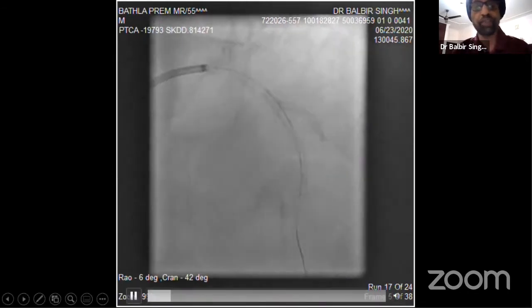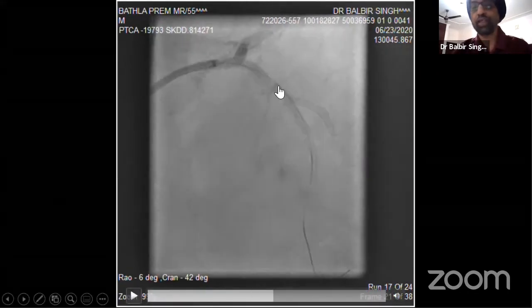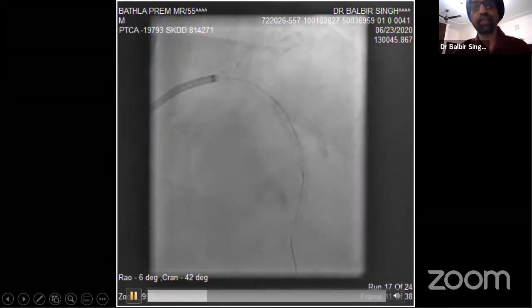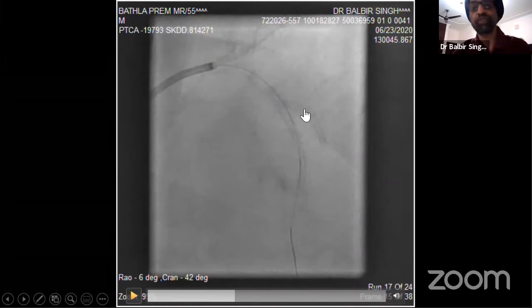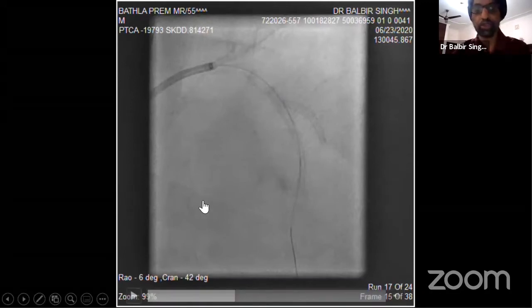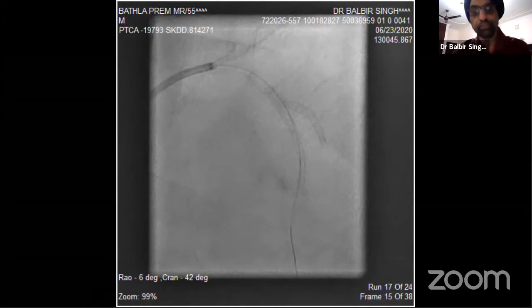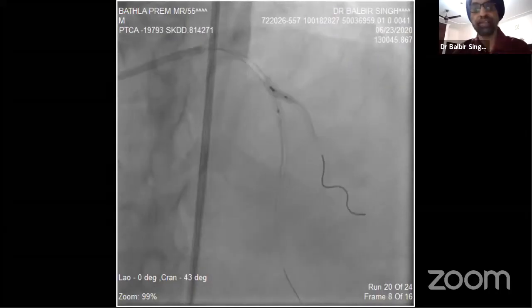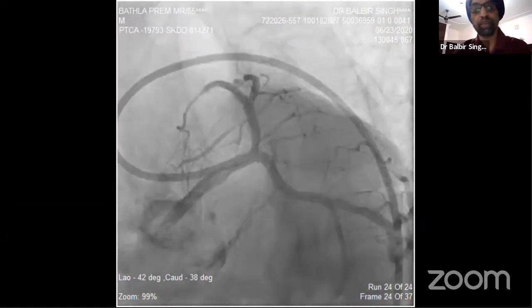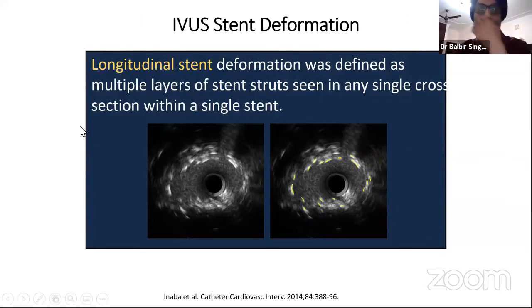But if you look carefully at this stent, this part of the stent shows deformation, because on StentBoost you would see this very clearly. See, this part of the stent looks different from this part. So there is some overlap of cells which causes the deformity. So one should be prepared to handle this situation. Once you get it, it's a difficult situation, but using Guideliners, using all these techniques, final kissing was done, and we got a good result in this lesion. This patient has done very well. So diagnosing by IVUS is looking at multiple layers of stent, which means it is deformed.